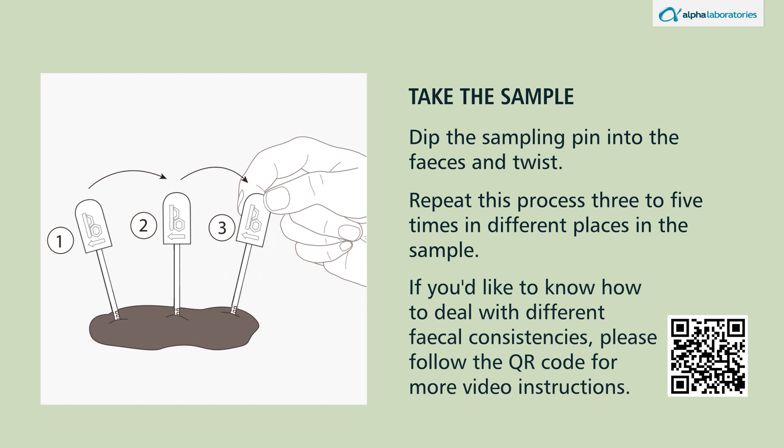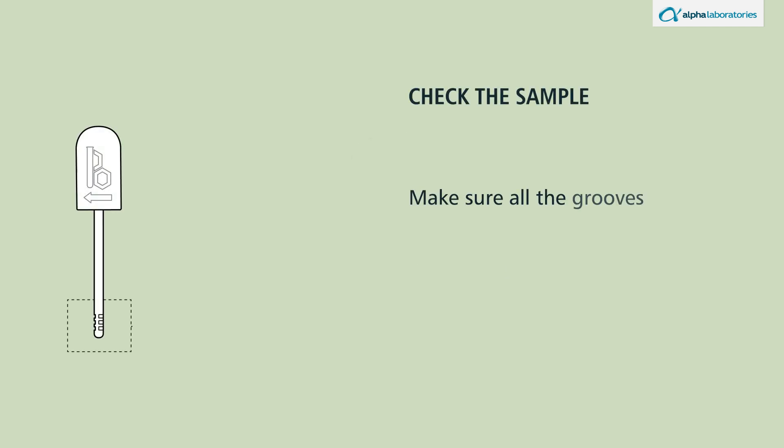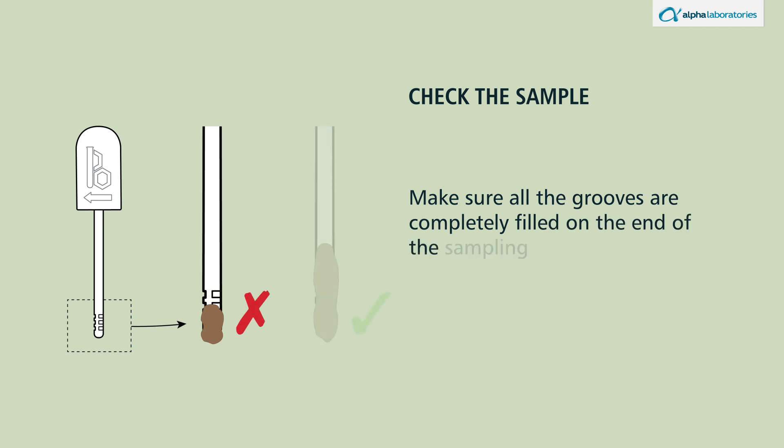Check the sample. Make sure all the grooves are completely filled on the end of the sampling pin.